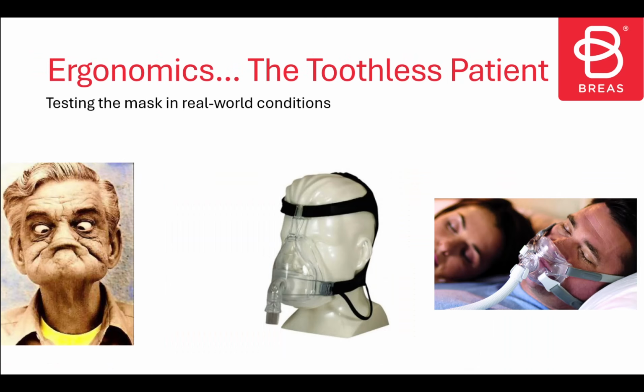For patients who do not have teeth, it is always necessary to test in real conditions. That is, if the patient sleeps with dentures, they should be tested with them. If he sleeps without dentures, you should test in this situation. And in these cases, you should choose masks that have good support on the lower maxilla.